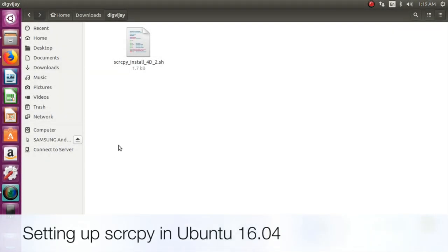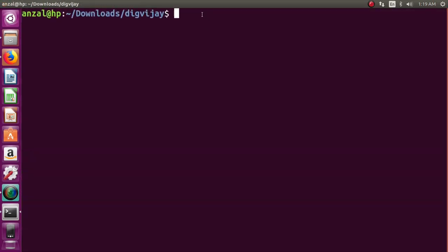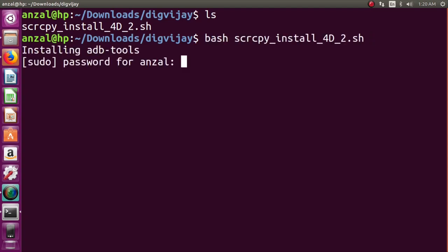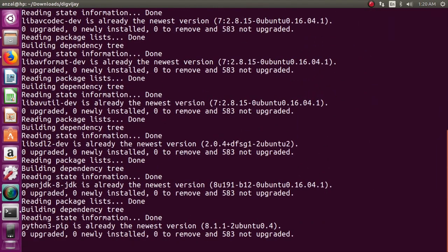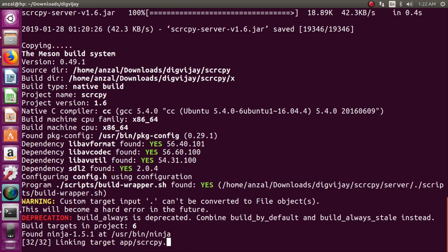So scrcpy is also available for Linux, and to make things easier, we have made an installation script for Ubuntu, and it's tested and runs well on Ubuntu 16.04. It basically installs all the dependencies and scrcpy itself. So just download it from the description below and keep it in a suitable location. Right click on the directory, select open in terminal, and just type the command bash scrcpy_install_4d_2.sh, which is the name of the file. Just key in your password. I've installed all the dependencies in advance, so it's not taking that much time. Otherwise, it usually takes a decent amount of time.